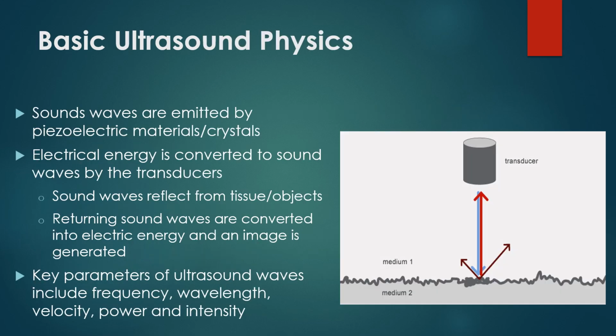So just to go over a little bit of basic ultrasound physics without putting anyone to sleep, sound's a mechanical wave which requires a medium in which to travel. More accurately, it's a series of pressure waves propagating through a medium, and the speed with which an acoustic wave travels through a medium is determined by the density and stiffness of the medium. The greater the stiffness, the faster the wave will travel, and some of the correlations to this are sound waves travel faster in solids than liquids or gases.